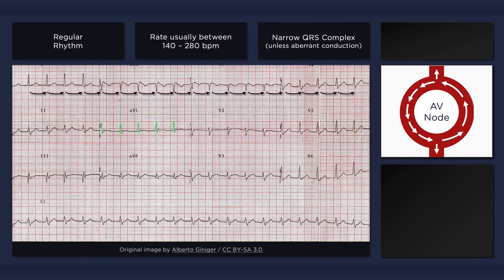Antegrade activation of the ventricles via the normal pathways from the AV node results in a narrow QRS complex. However, pre-existing aberrancy, such as left bundle branch block, can result in an AVNRT rhythm with a wide QRS complex.